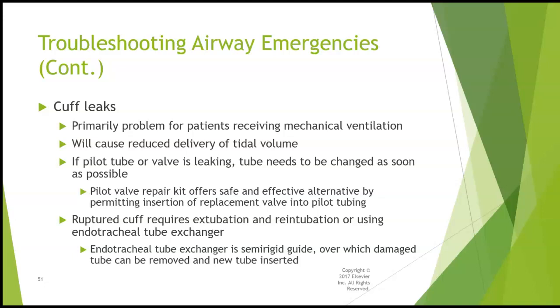It's just something that you're going to insert into the old endotracheal tube. You can slide the old one off and then use that as kind of a fast track to putting the new one on. And we also have ones that are called Cook tube exchangers, and Cook tube exchangers actually have a port that allows you to ventilate through, but bougies don't.